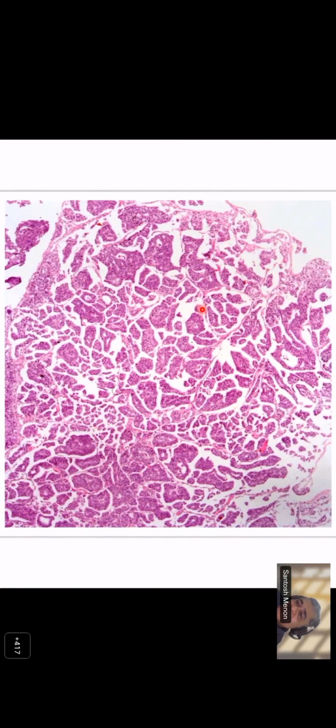Parul, you agree? Yes, sir, definitely. In the history also, they have said they have suspicion of lymphovascular invasion. Okay. But I think this is not lymphovascular invasion. This is due to the retraction of the tumor. You see the size of papillae, how variable they are. Some are large, some are small, floating, very variable kind of. Definitely, sir. They are micropapillae, variable here. Yes, sir. Fine.